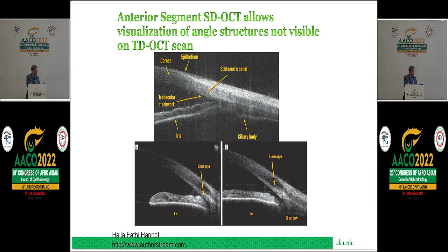And although I will not spend too much time, I think the important thing is to identify the scleral spur when you are looking here, which is the convergence of the innermost aspects, and then see if the angle is open. And the trabecular meshwork and Schlemm's canal is about 500 microns in range and about 500 microns from the root here. So if this is the scleral spur, this is the meshwork here. And in this case, you can see that the angle is actually quite narrow over here and almost closed on this part. So you get some idea. And you know, if you're looking at plateau iris, for example, after iridotomy or iridectomy, this can be very helpful as well.